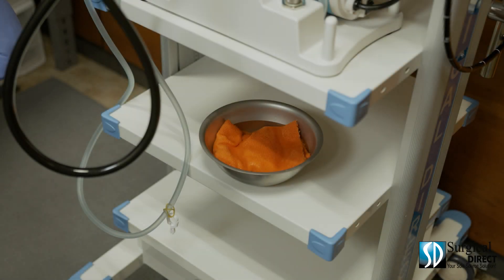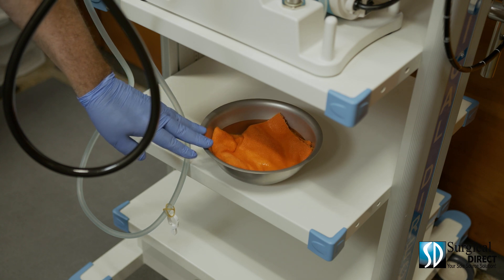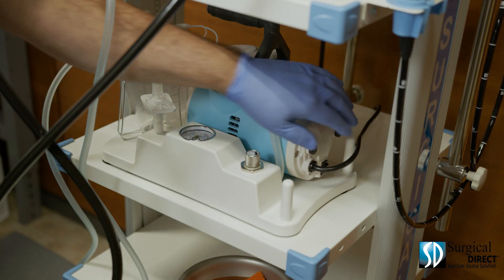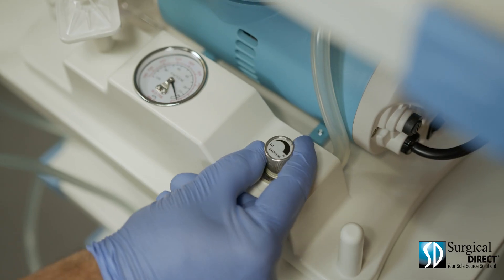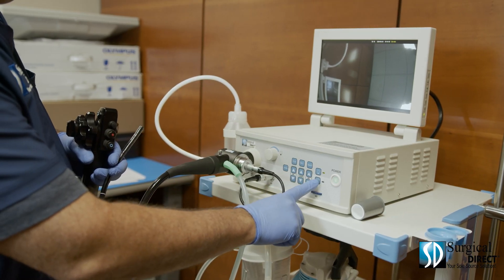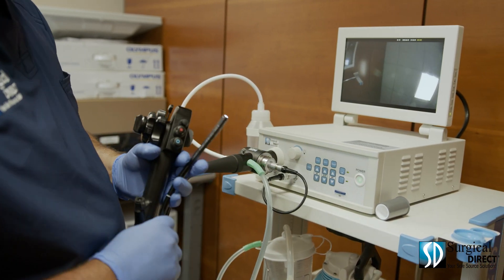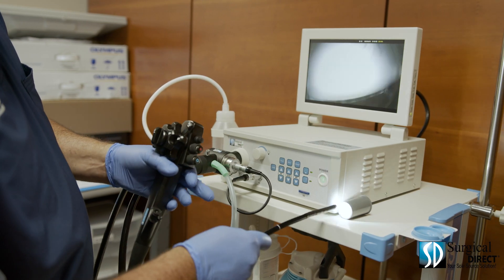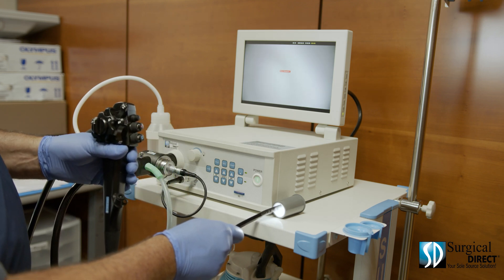When setting up for any procedure, you want to have a bowl prepared with water, enzymatic cleaner, and a soft sponge. The next step is to turn on your suction — make sure it's set to high. Turn the light on and the air water. You'll need to white balance by either using a white sponge and completely enveloping the scope, or a white balance cup.